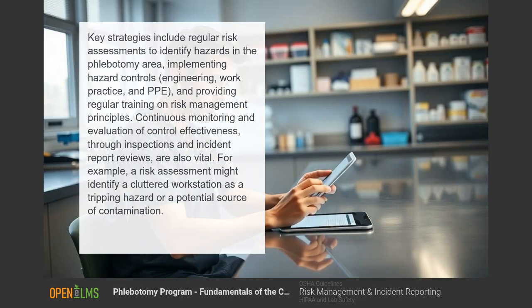Key strategies include regular risk assessments to identify hazards in the phlebotomy area, implementing hazard controls, engineering, work practice, and PPE, and providing regular training on risk management principles. Continuous monitoring and evaluation of control effectiveness through inspections and incident report reviews are also vital.